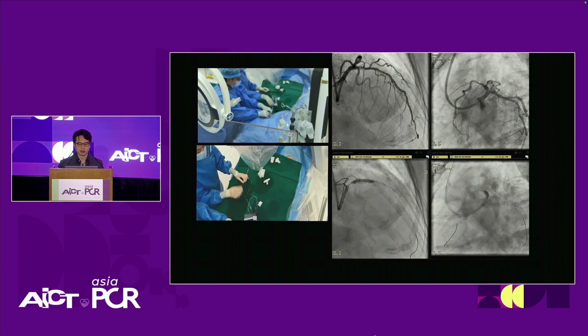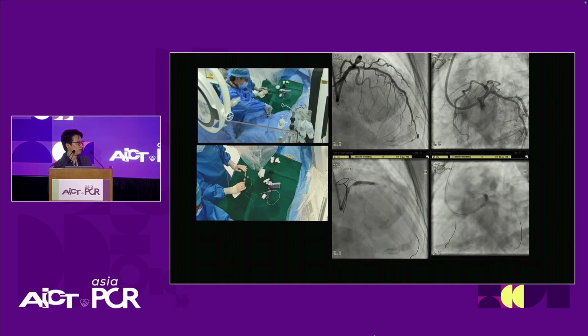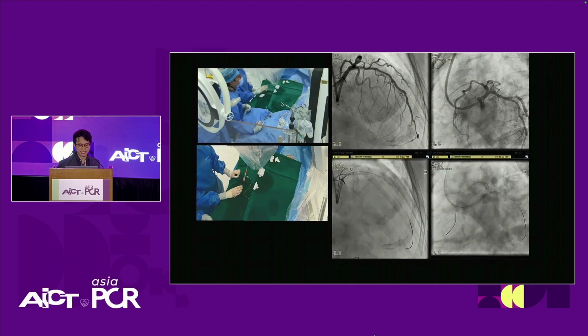Essentially, that helped modify the superficial calcium and superficial aspects of the plaque. With a cutting balloon, of course, you get deeper expansion and you get into the tunica media. And the rota before the cutting balloon does make the procedure more predictable, less chance of uncontrolled dissection during cutting balloon inflation, which is what Hui Wen did very well. She did the entire procedure. I was just wiping wires for her and injecting contrast, basically.